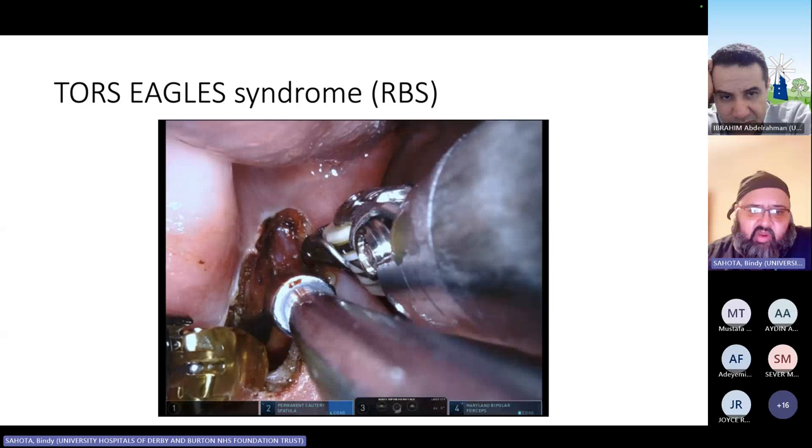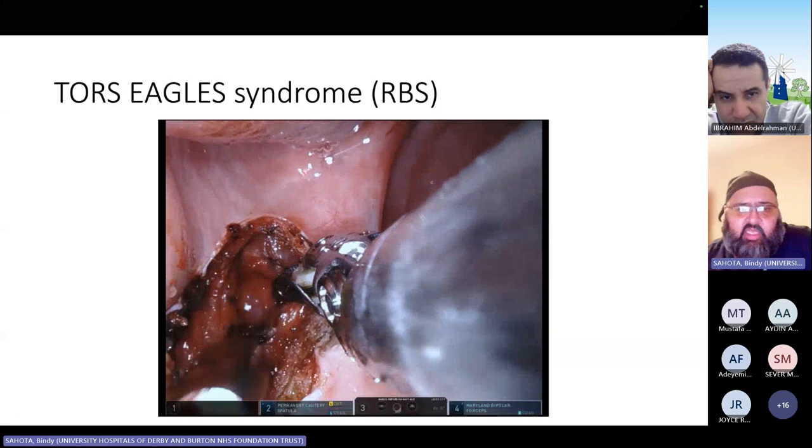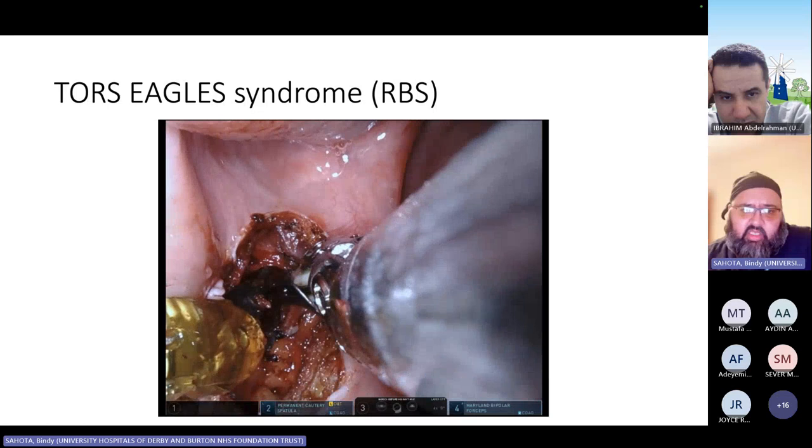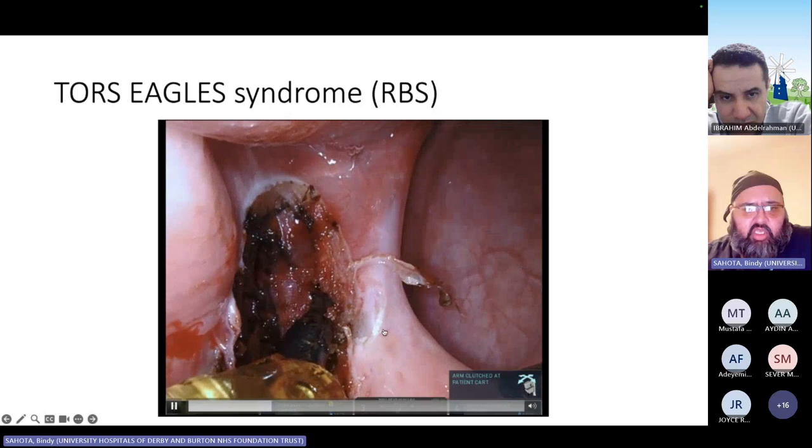Here we're coming down on it. Here's opening into that parapharyngeal space and opening that all up. You can see the raphe, you can see part of the pterygoid up there at the top. Here's dissection further down, opening that up, and again, I'm just keeping that tonsil intact.